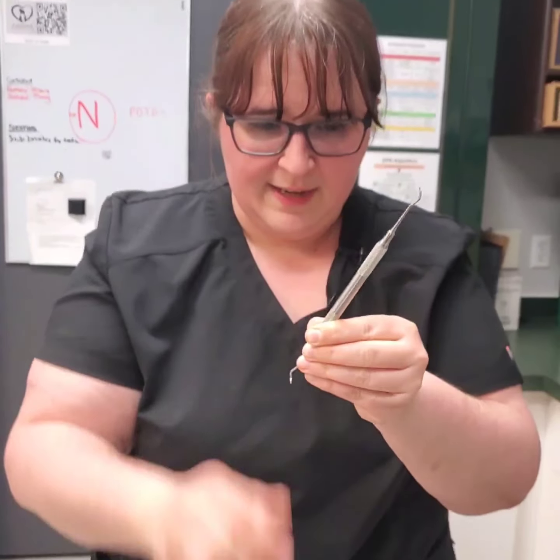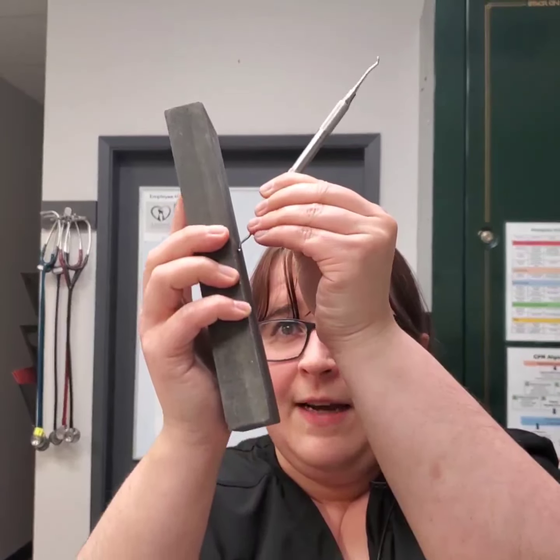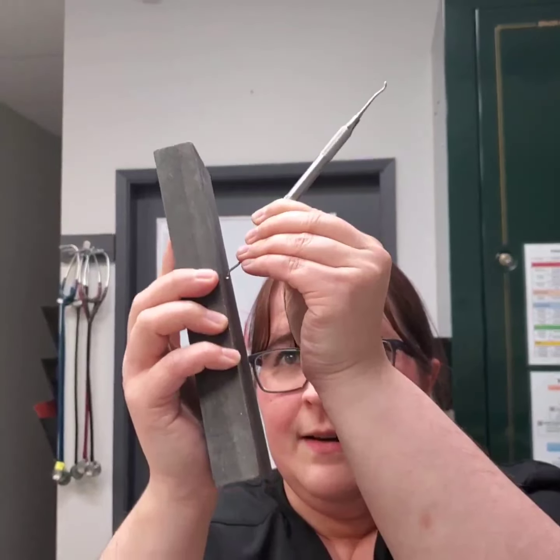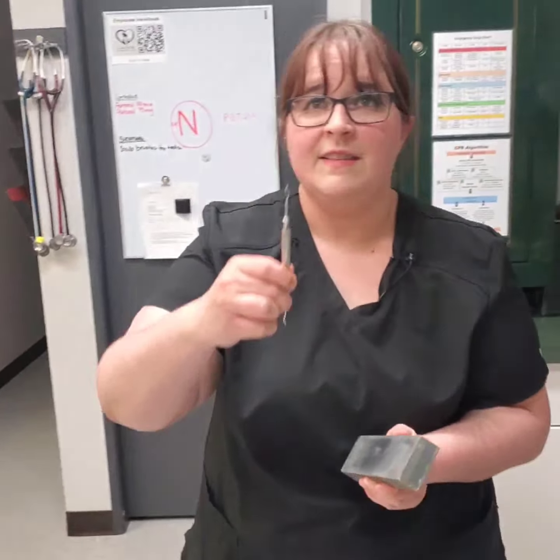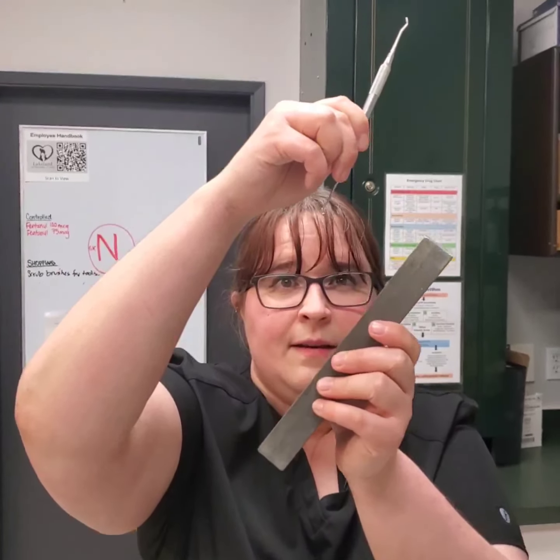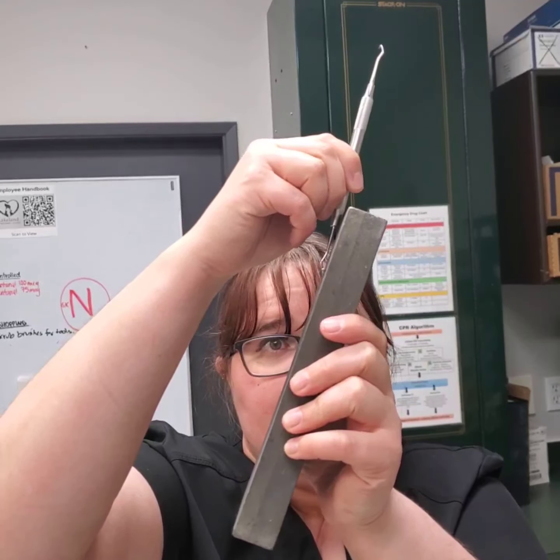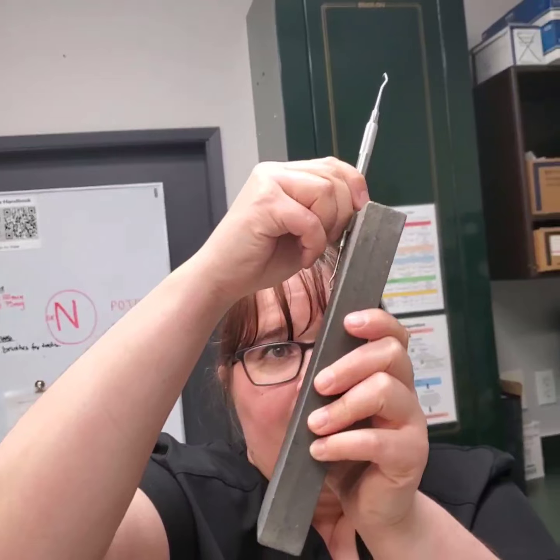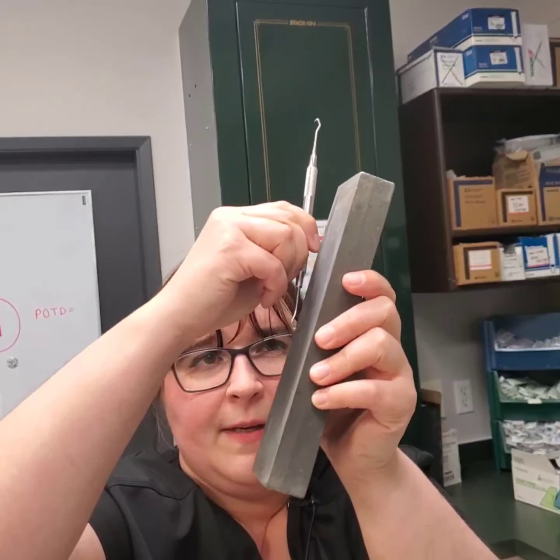And now I'm going to switch hands. Oh, and making sure I'm getting my angle right, I do want to move towards the tip to make sure that the tip stays a sharp point. So now I'm going to switch hands so that you can see what I'm doing, and I'm going to line up my angle. Here I'm going with the 11, and I'm going to go up and down, working towards the point where we had our oil.